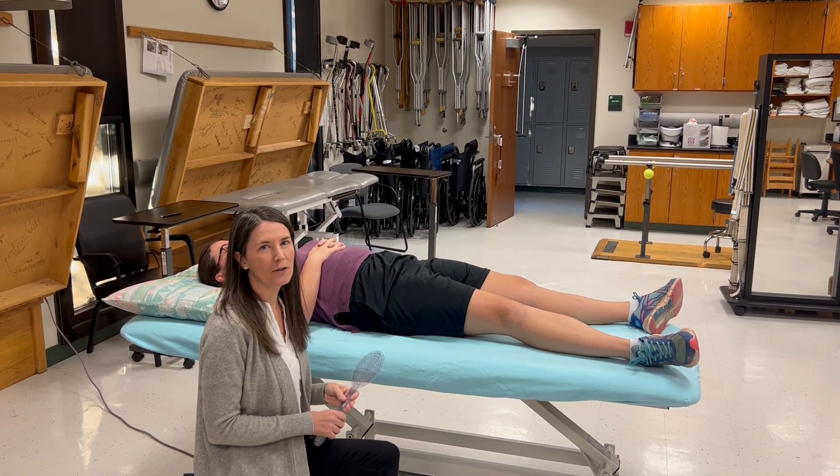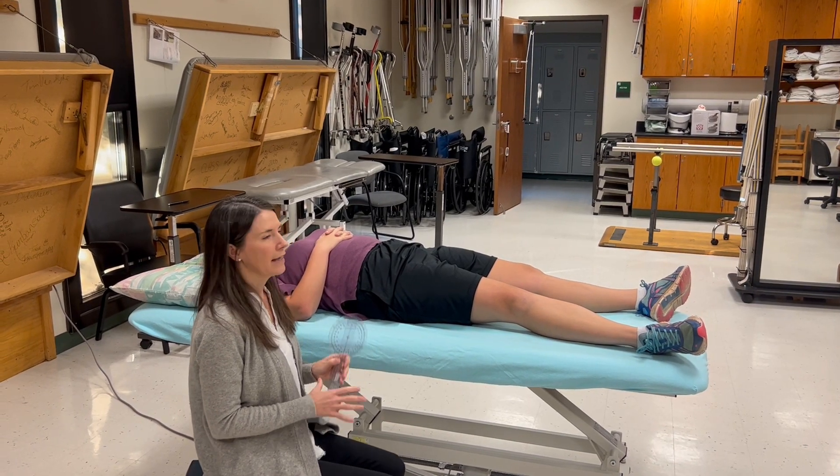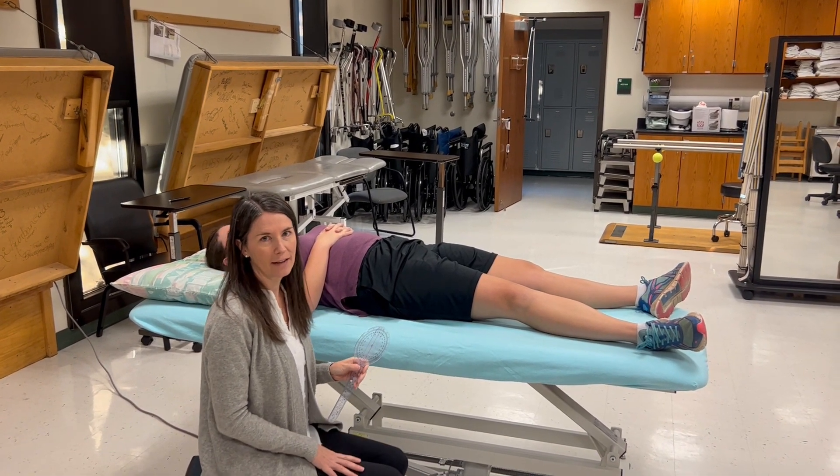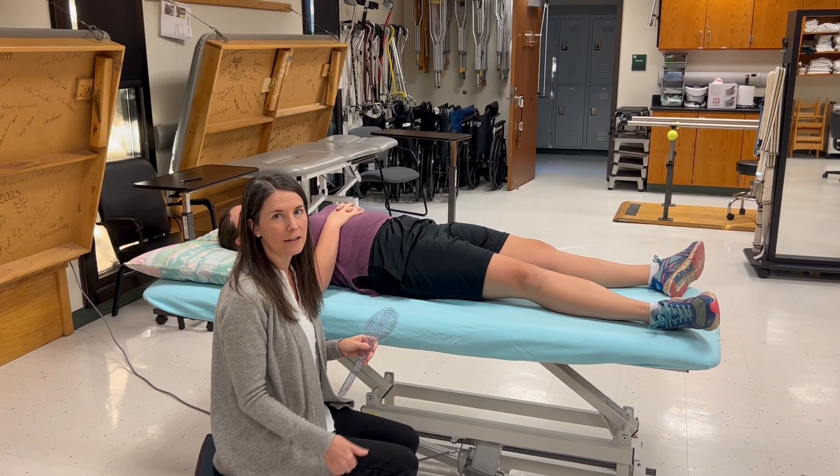In this video we are going to do goniometry and manual muscle testing for hip flexion. Hip flexion happens in the sagittal plane. The normal end feel is soft and the normal value is 0 to 120 degrees.